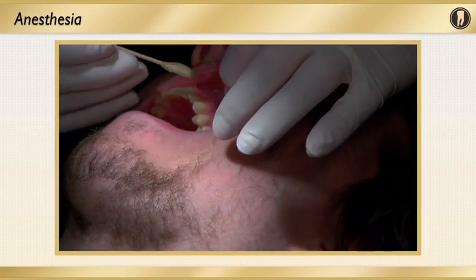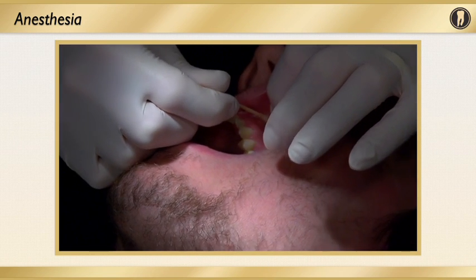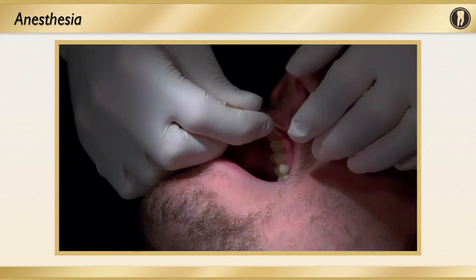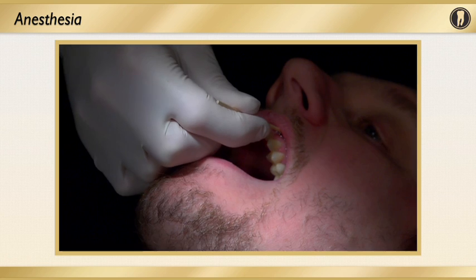All right, let's discuss maxillary anesthetic. Here's a video where the first thing you want to do is apply topical anesthetic. This is a very sensitive area up here. So help yourself out, help your patients out. You want to be gentle, give them topical.